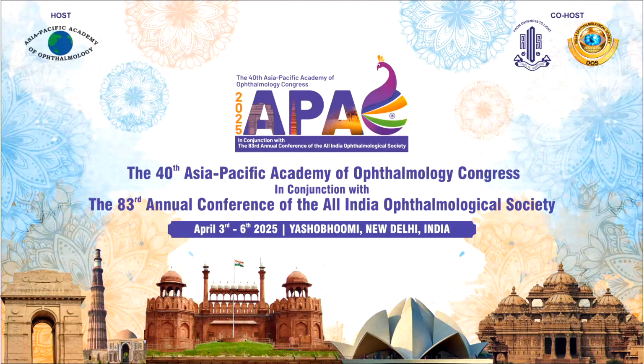You're absolutely right that in the absence of noticing cotton wool spots in the past, I also diagnosed these as glaucoma. It is only now that I'm realizing that many of these are not necessarily glaucoma. And now I am doing a study which is near completion to identify on OCT what is the finding that can identify that this is coming from an old cotton wool spot and not glaucoma, which I'll be sharing next time. Thank you.